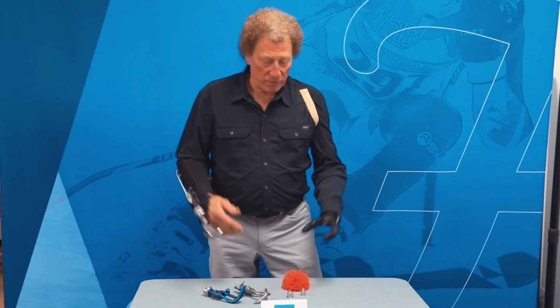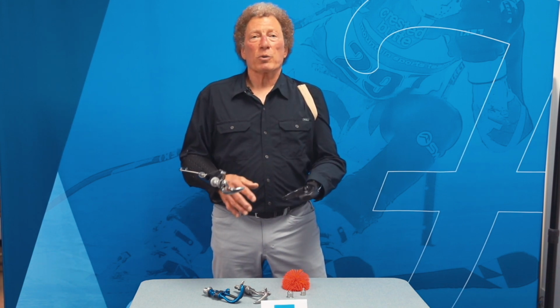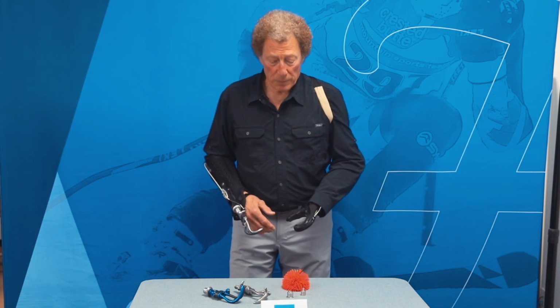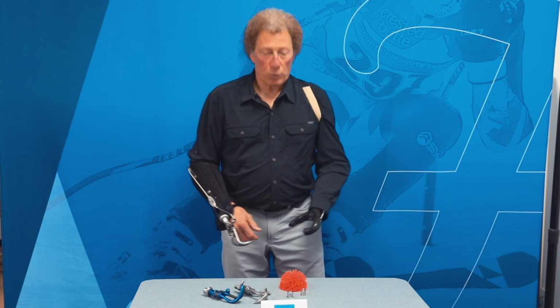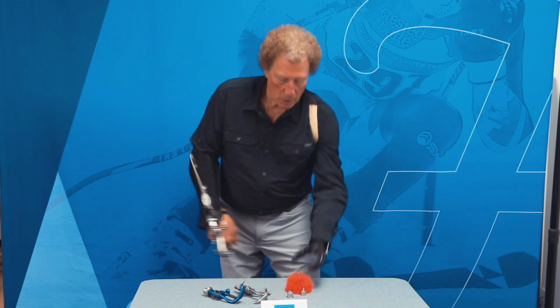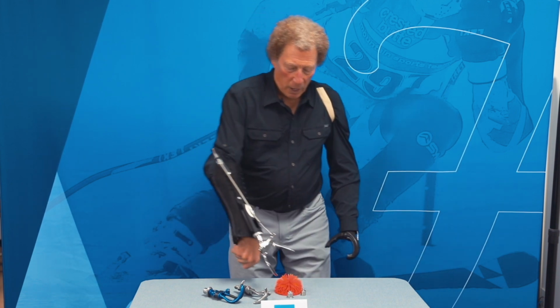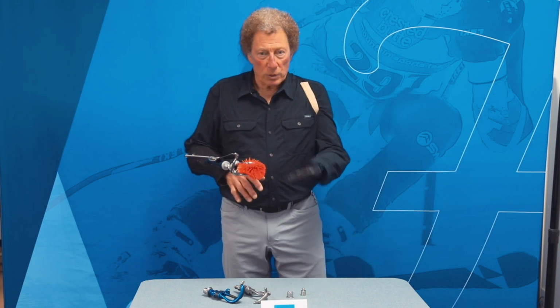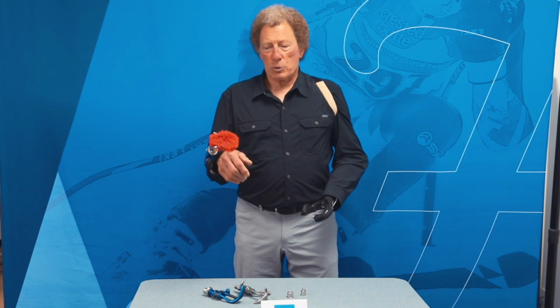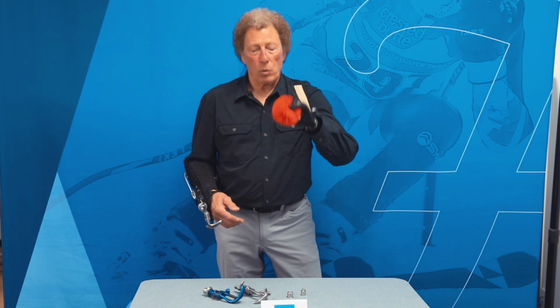I'd like to demonstrate a few features or functions that really show you a difference between voluntary opening and voluntary closing. First of all, just spontaneous reaching and grasping. With a split hook, I've got to open and close. You can see the difference in the speed. I simply reach and grasp. I've got to open and close that way. So there's a little delay in function. Again, the split hook is holding on without any effort. I'm having to put a little bit of effort in to hold this ball.